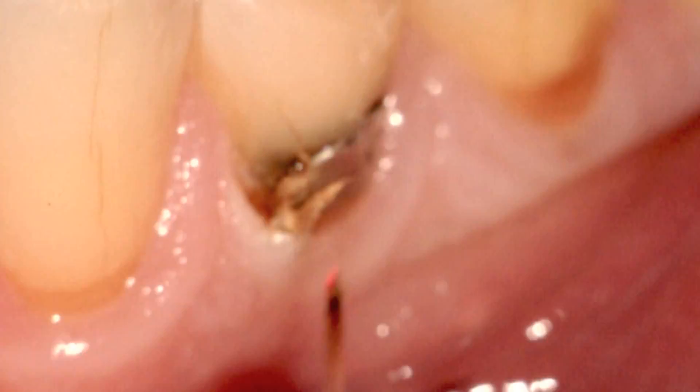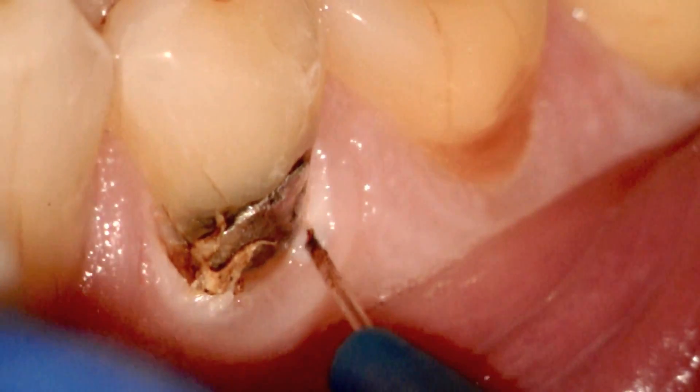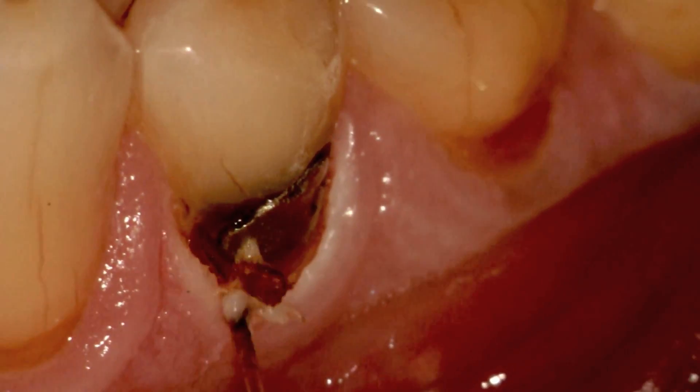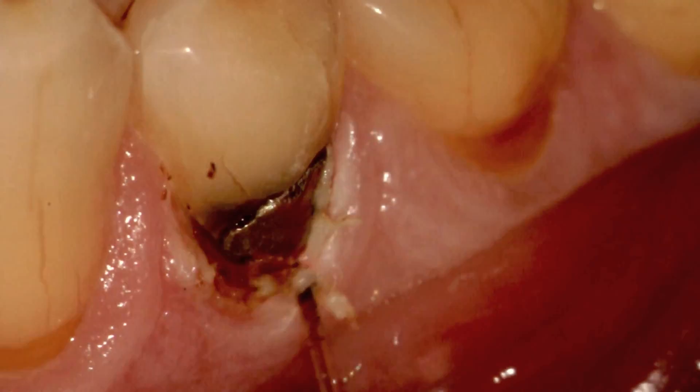With this case, we're using the laser at 0.9 watts in short brush-like strokes, trying to be careful to not remove excess attached tissue and create a muco-gingival defect. We're just using short brush-like strokes to try and expose the gingival aspect of the amalgam.